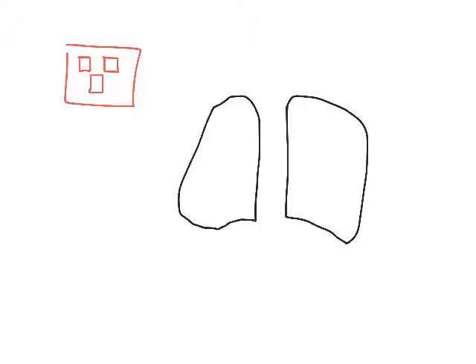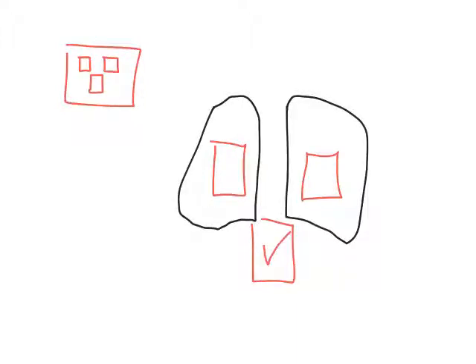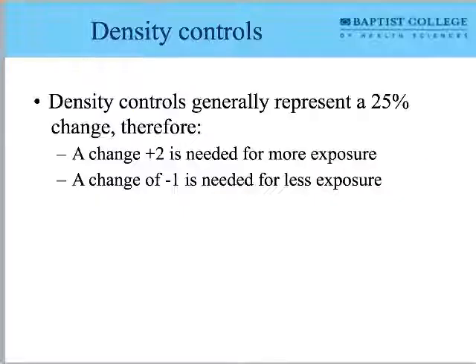So if I have an ion chamber here and an ion chamber here, but the ion chamber here is the one that I activate, the problem with this situation is it will burn out the lungs, but give me a very pretty picture of the thoracic spine. So the rule here is whatever piece of anatomy you want to get a picture of, put it over an activated ion chamber. But nothing in life is quite that simple.